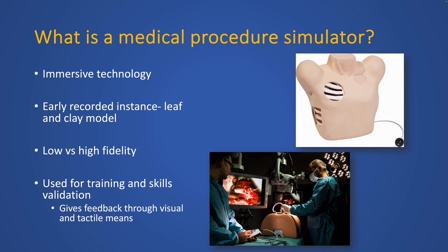The earliest recorded instance of a medical procedure simulator was a clay and leaf model in India around 600 BC. This simulated a nasal reconstruction with forehead flap. Later in the 1980s, patient simulators, which were computerized mannequins, made their debut in anesthesia training.